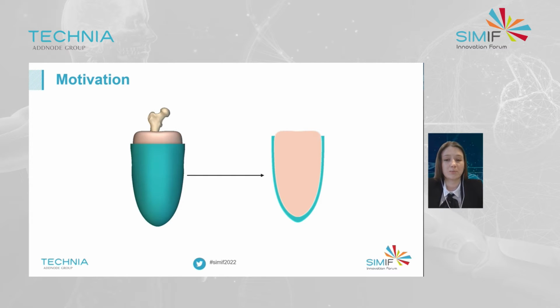The interface pressure between the residual limb and the prosthetic socket significantly affects patient comfort. Due to the individual anatomical shape of the residuum, it requires a high level of customization. And in the conventional procedure, fitting a prosthetic is an iterative process, and finite element analysis delivers tools which enable us to evaluate interface pressure between the residual limb and the prosthetic socket and validate the socket shape. So this will allow us to speed up the design process of the prosthetic socket.